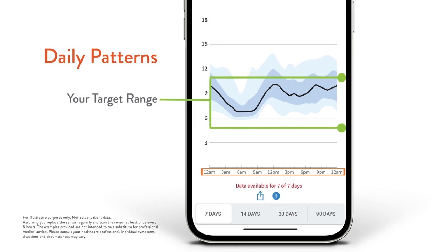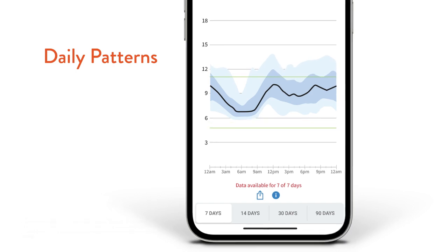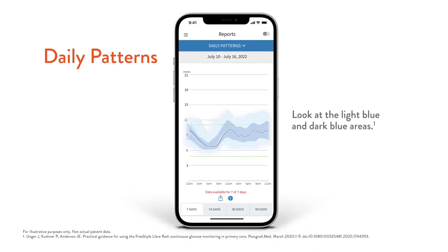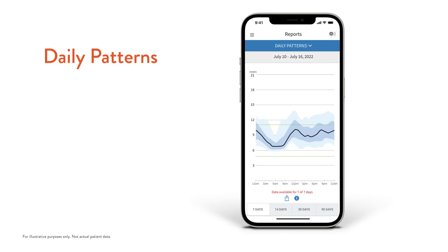Look at the times of the day this is happening. The thick black line shows the middle point of your glucose readings. It's also important to look at the curves on this line — when you're going up or down, or above or below your target range. Look at the light blue and dark blue areas; if you're using a reader, this area is grey. You want to keep these areas narrow, meaning fewer highs and lows. It helps you see where you can reduce low glucose events, increase time in target, and reduce your ups and downs.